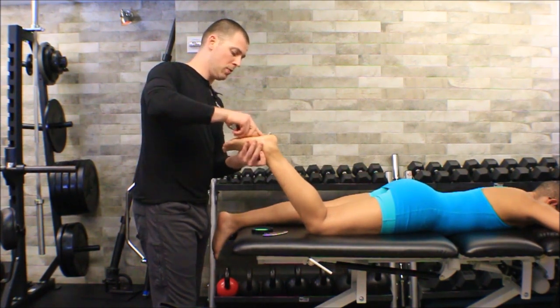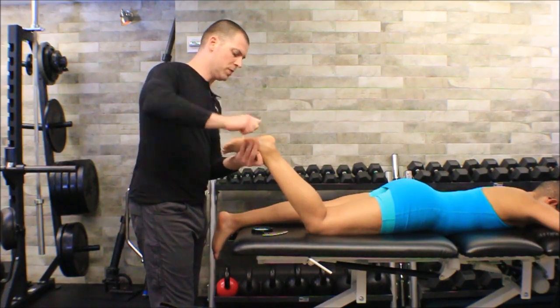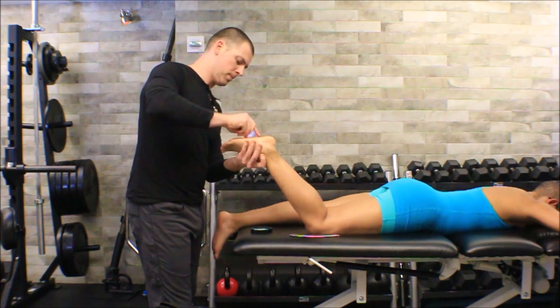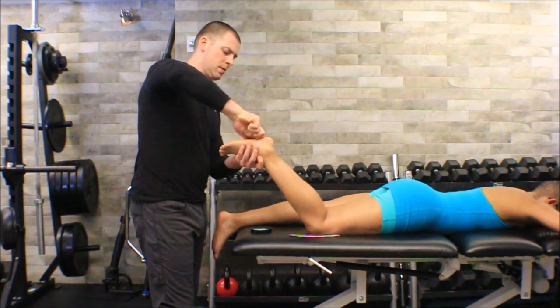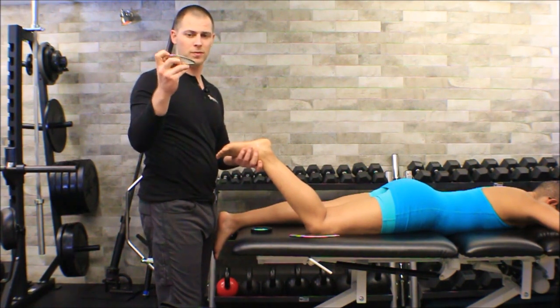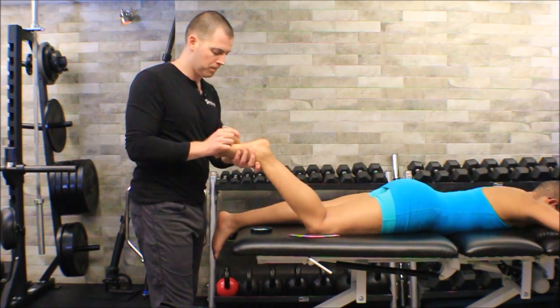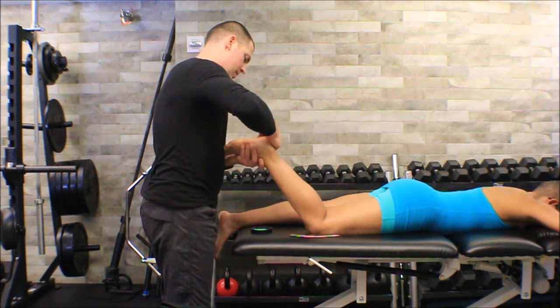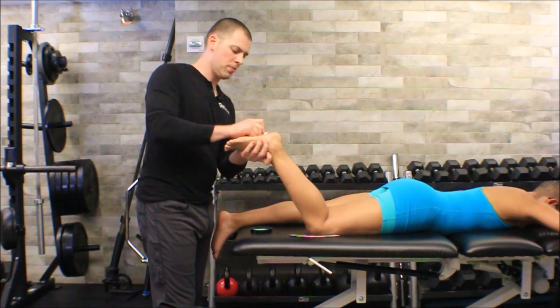So I'm just going to go ahead and go in a couple different directions here, right? If I felt like this tool was too big, I could go to maybe the sharp tooth tool, right? Come in, go that direction, go this direction, right? If I wanted to go across the foot, I'm not going to be able to use this surface, I might have to use just the tip here and go this way. All right, remember the disordered collagen matrix is going to go in any direction. All right, come through here.